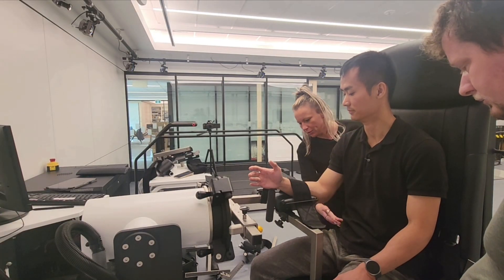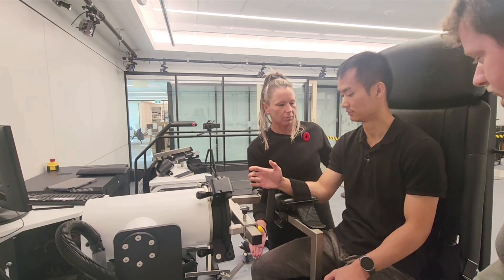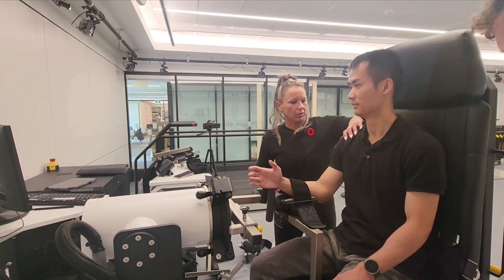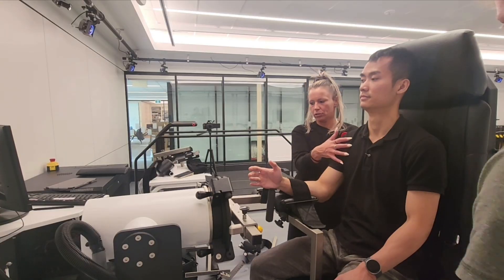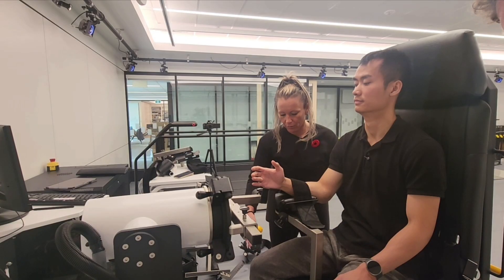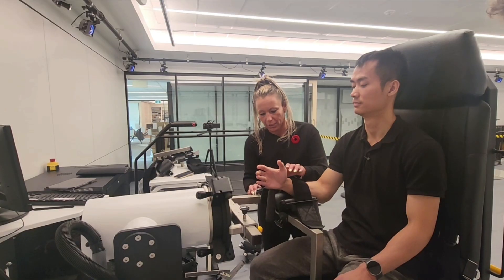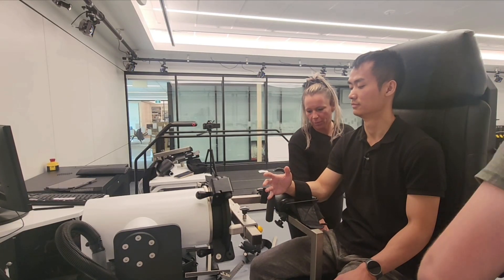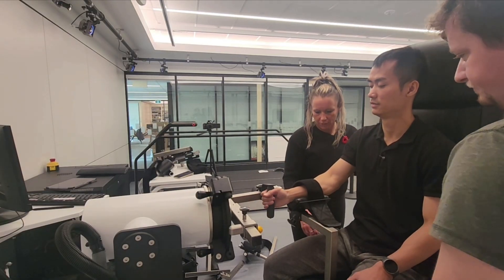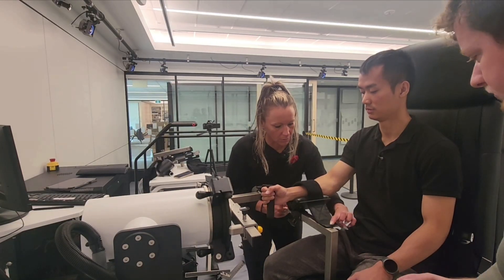So we feel good this way. As long as your knees are on the back of this, let them tell you how good that feels against their back. As long as when you relax back your shoulders come back, you would be good as well. So we have chair forward up, seat forward up, and back forward up. We probably could move him completely backwards a bit to get your hand underneath it. This is the height it's supposed to be, so this is the one that has to move.